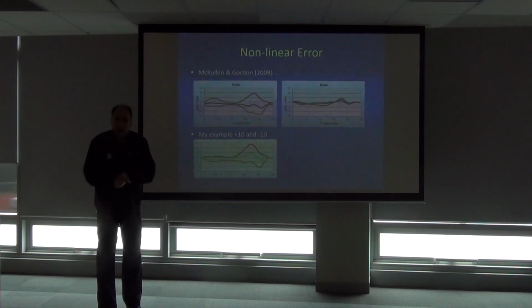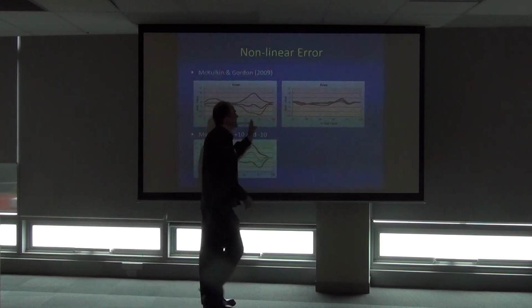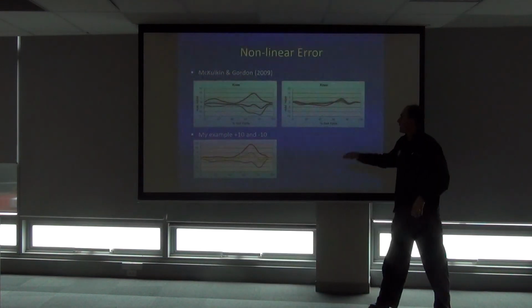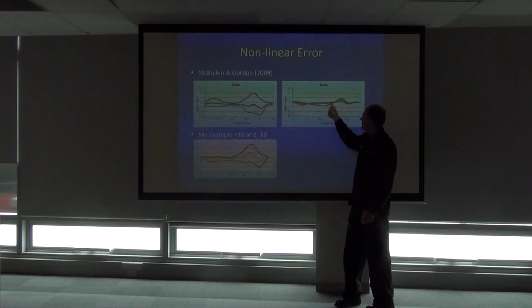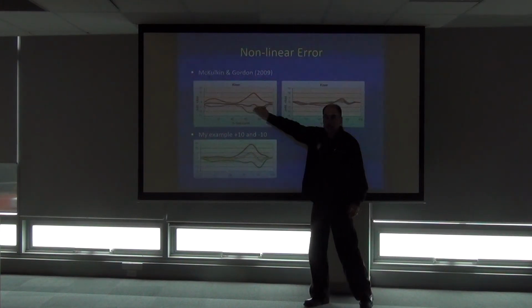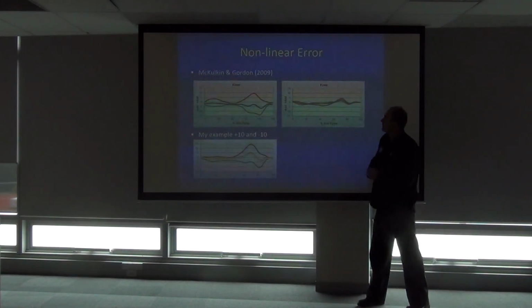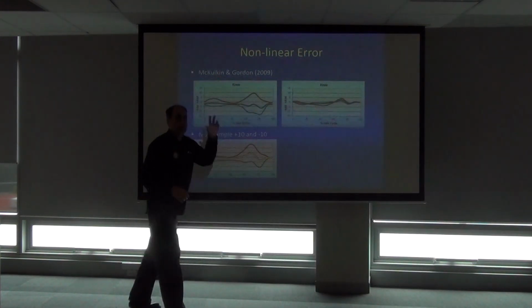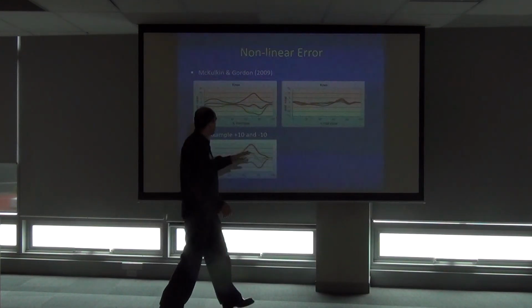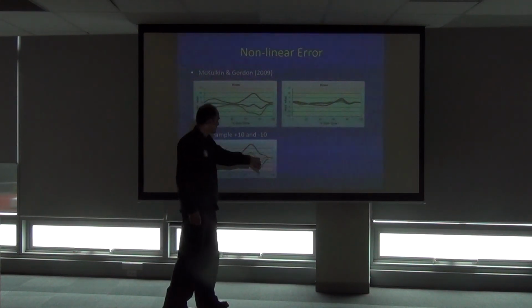Come up with some approximate values for what the correction should be, feed them into the formula, and it spits out a corrected knee joint rotation. It didn't quite come out ideal, it didn't all converge on one line, though this one did, but it did remove the error to see what's going on, and it approximated more closely what was going on here.